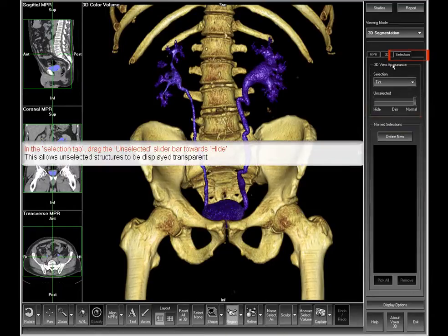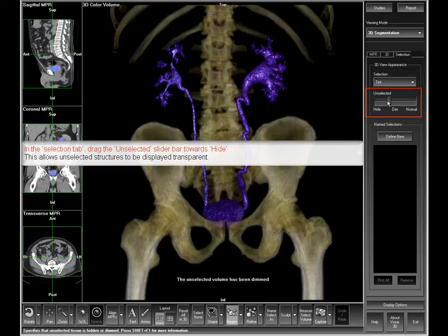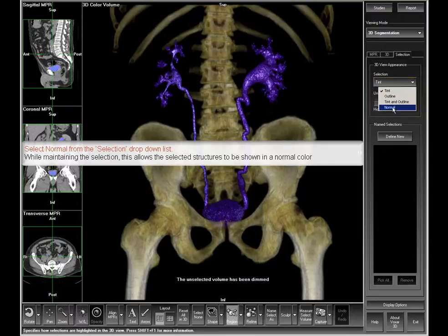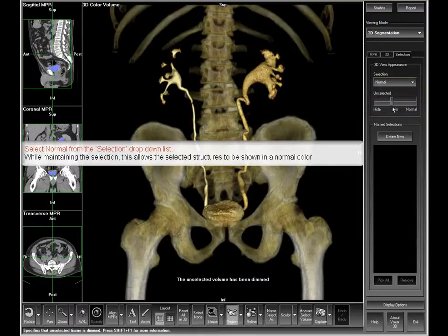Go to the selection tab and dim the unselected structures in the view by dragging the slider bar to the left. Select normal from the menu options to remove the blue tint on the selected structures.